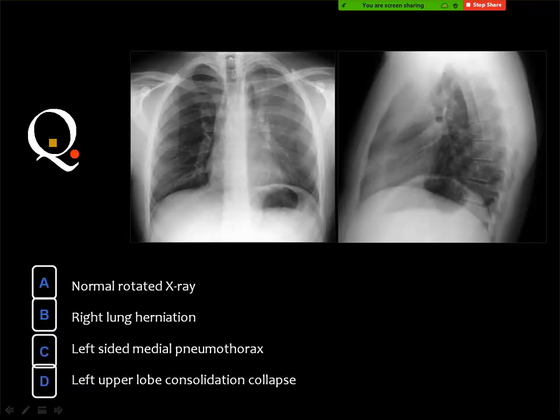Then Dr. Mamdouh, can I ask about COVID infection superimposed in a patient with trauma? Nowadays, it's problematic, asking whether it is COVID or contusion. You mean a patient with COVID pneumonia who is subjected to trauma, and you want to discriminate between COVID opacities and the pulmonary contusion? Yes.